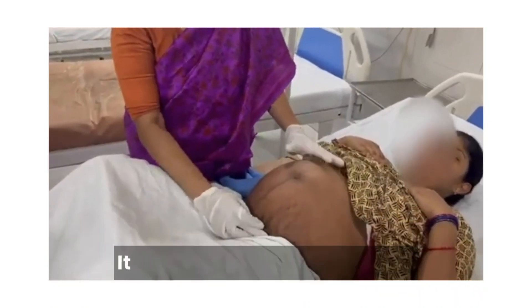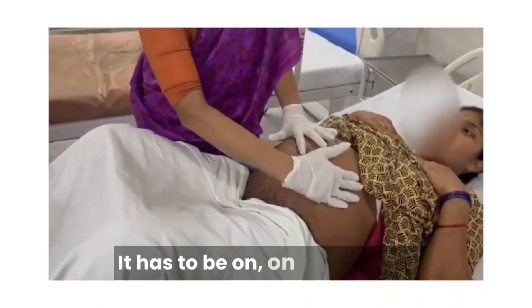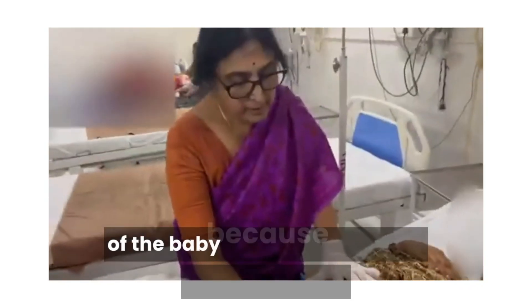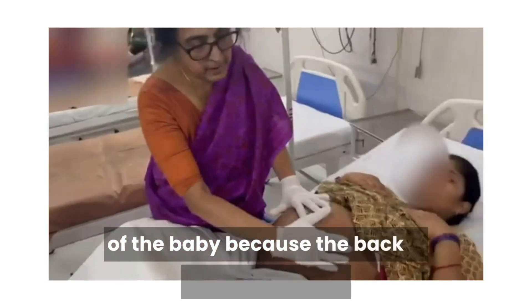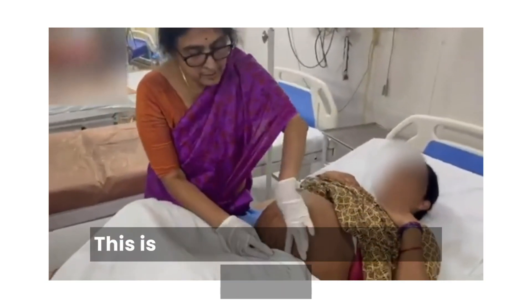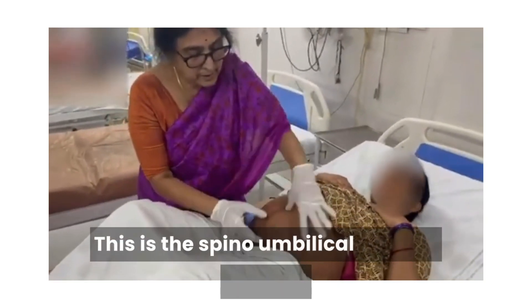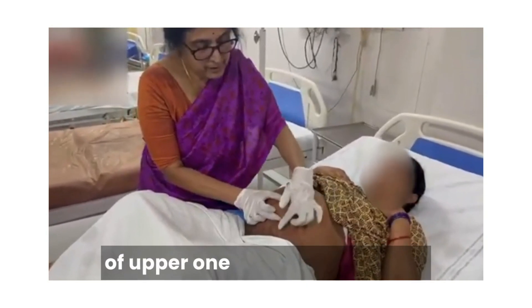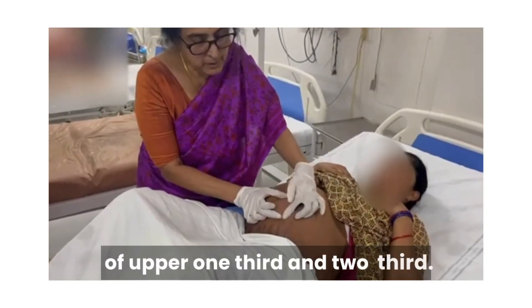Where is the fetal heart? It has to be on the left side of the baby because the back is occupying here. This is the spinoumbilical line, the junction of upper one third and two thirds.